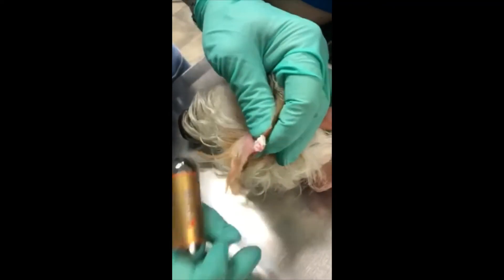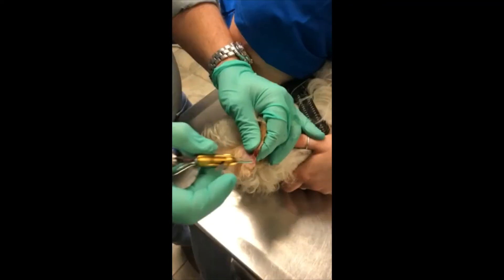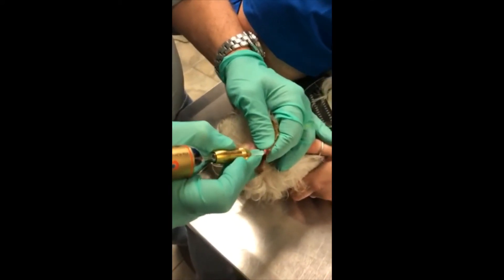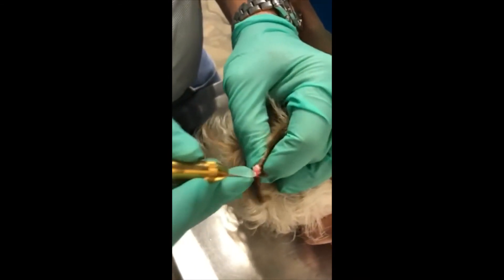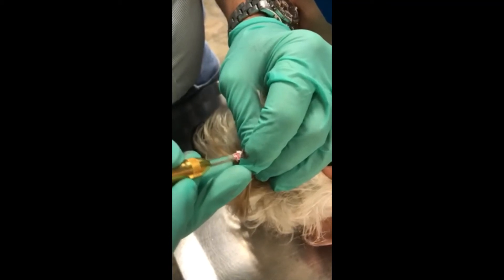So there's the 40 second freeze. We're going to shut the video and come back after the thaw cycle. Following the thaw cycle, we're going to go ahead and refreeze. We're looking for the most rapid freeze that we can get directly on the tissue, as that creates the greatest damage on a cellular level.